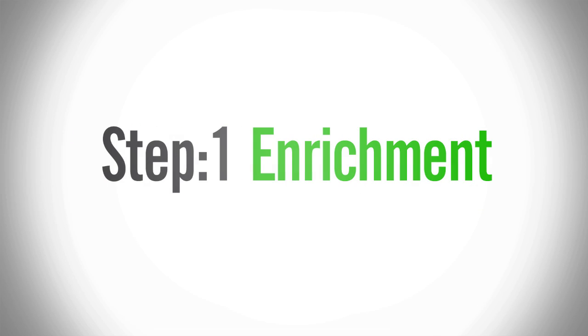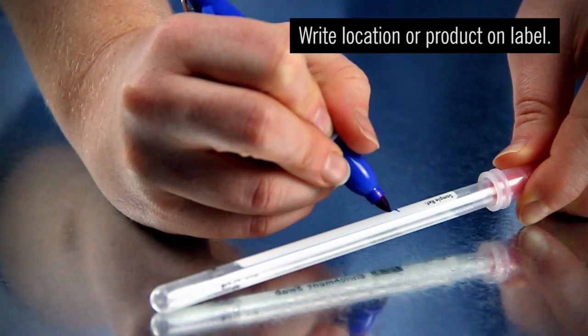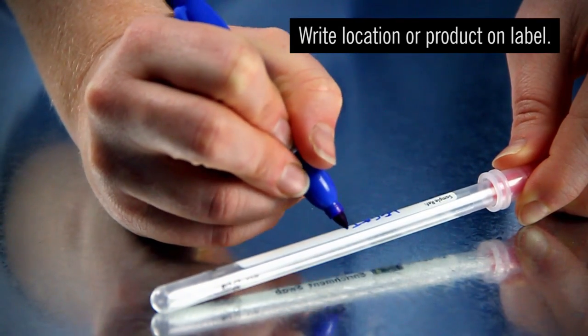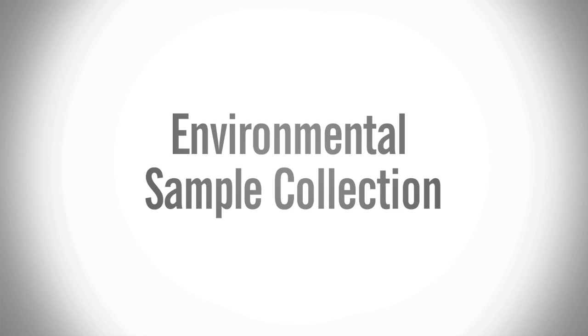MicroSnap is a two-step test. The first step is the enrichment step. Write the location or product on the swab tube label for easy identification. For environmental samples, you may collect a sample just like you would with an ATP test.